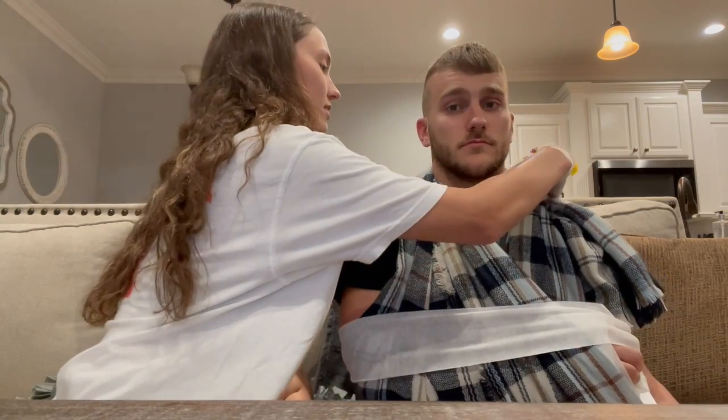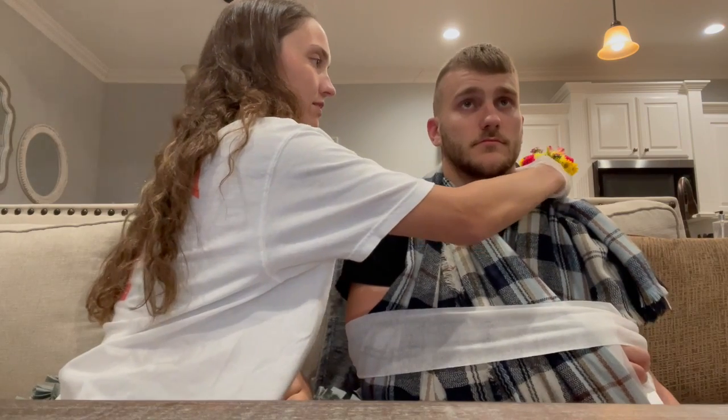The center of the binder should be placed over the arm. The hand should be in a thumb up position within the sling and slightly above the elbow. Now you need to place padding underneath the knot of the neck for comfort. You should make sure to adjust the sling to support the hand and wrist. Only the fingers should be exposed.